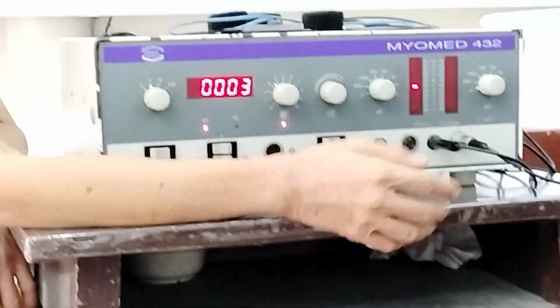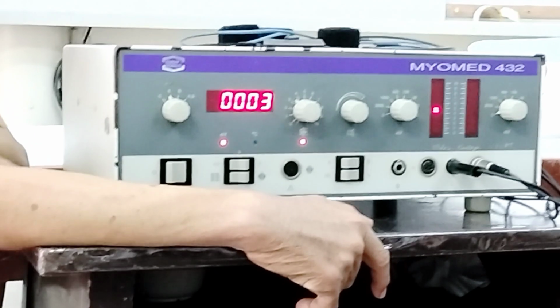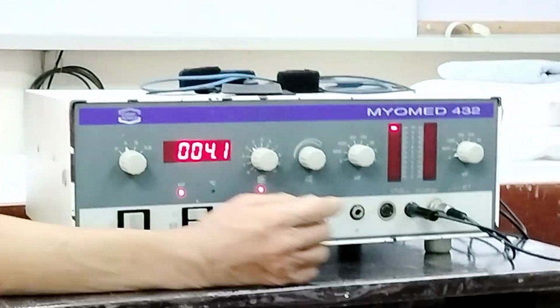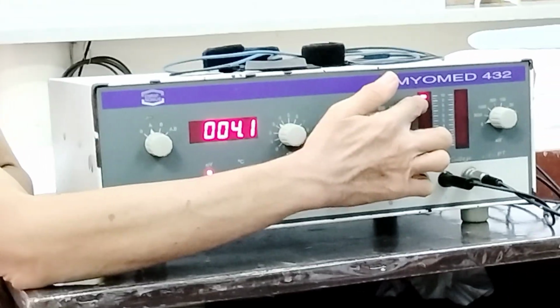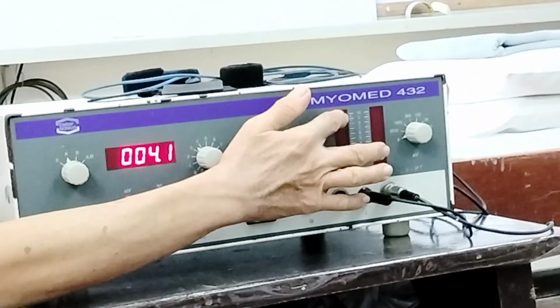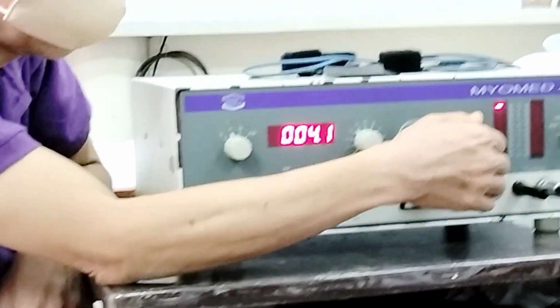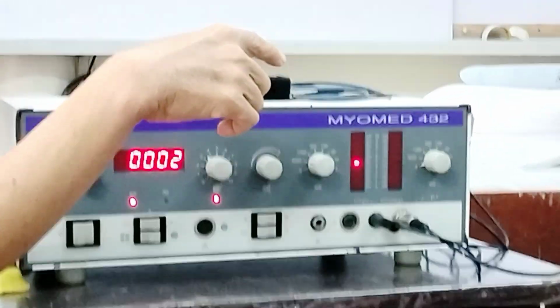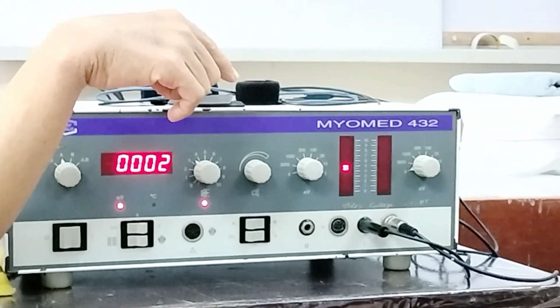Okay, so again, going back, if you have muscle weakness or flaccidity, as we mentioned, we start with 3. If you place it at 3 and the bar is full at level 10, then what you do is progress further to 10. Once you notice that the bar is not at the fullest level, that is the level where we start the training.